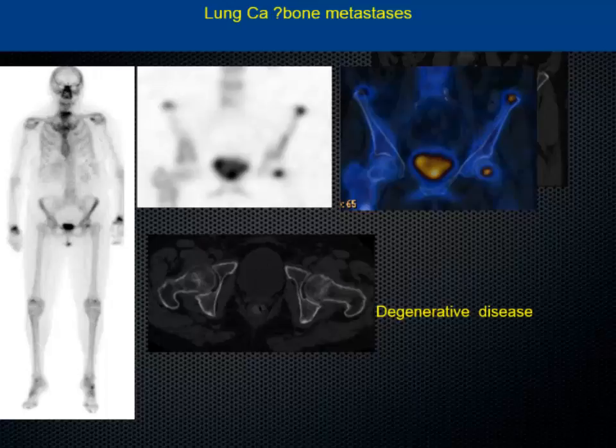So if it was prostate, especially the sclerotic metastases are rarely fractured, because it is more like a concrete. So in patients with prostate cancer, if I see a focal uptake in the neck of the femur or the shaft, I'm not that much worried. But if I see some uptake in the shaft of the femur or the humerus in a patient with breast cancer, you need to call the orthopod or the clinical team to do a local x-ray, or if you have a CT, then you have to say whether there is a fracture or an impending fracture, because it changes the entire spectrum of management. But if it's a prostate, you can always underplay, because it's a sclerotic lesion. It's less likely to break, because it's more like a concrete.